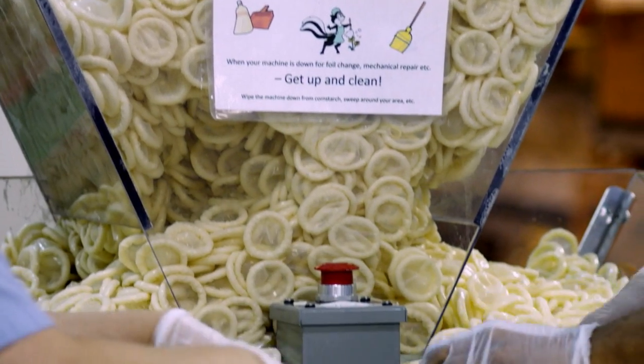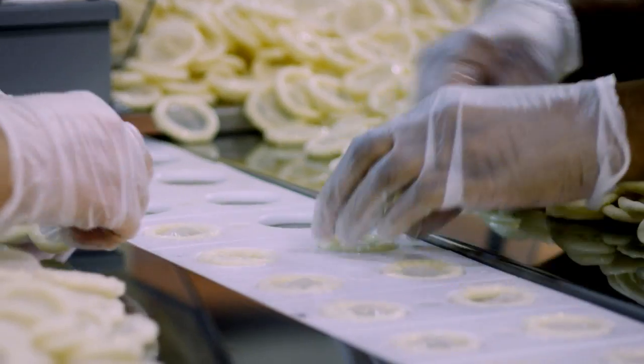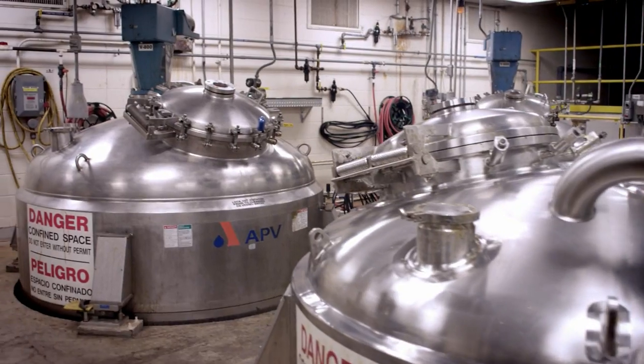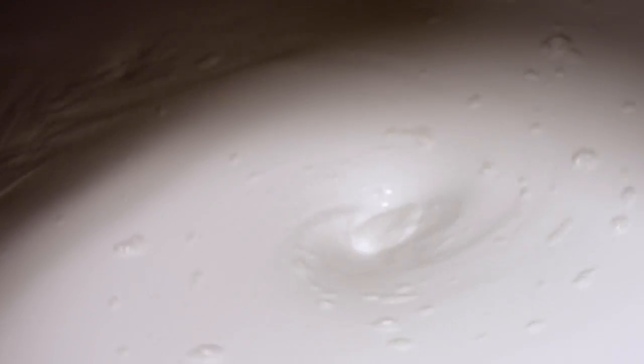If you ever wondered how they came to be called rubbers, it's because most condoms are made from natural latex, a remarkably strong and flexible material that comes from rubber trees.